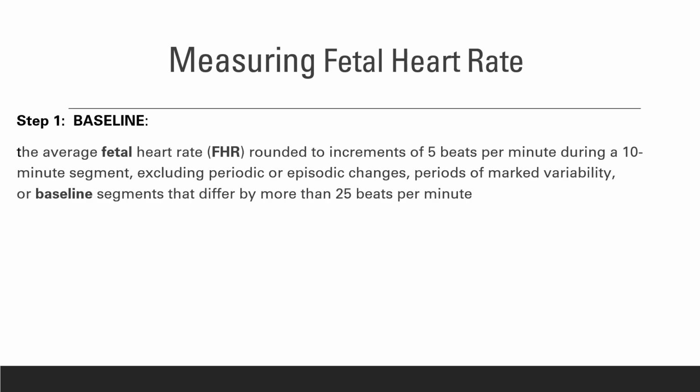All right, so let's focus on fetal heart rate. There are 4 steps when measuring fetal heart rate. It's important to make sure that we follow the step-by-step guide. Normal fetal heart rate is 110 to 160, 110 beats per minute to 160 beats per minute.